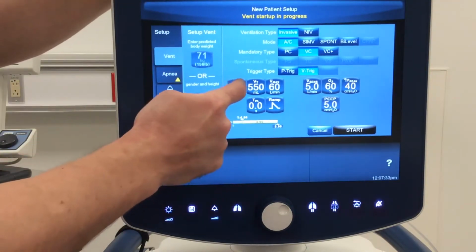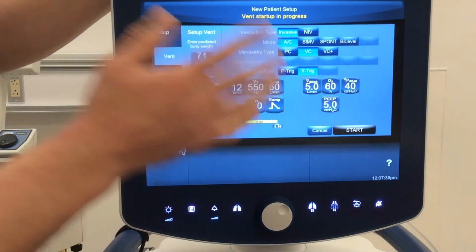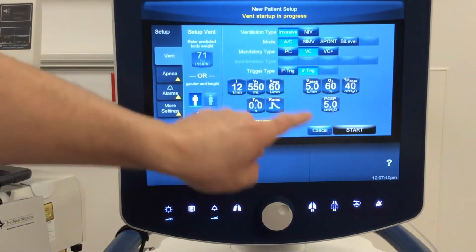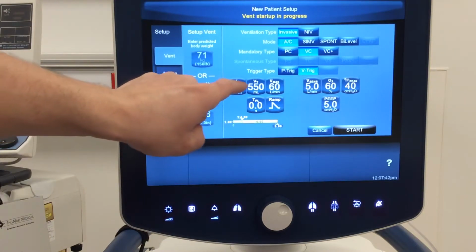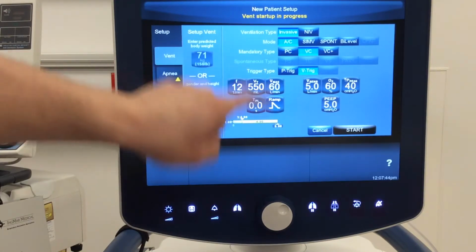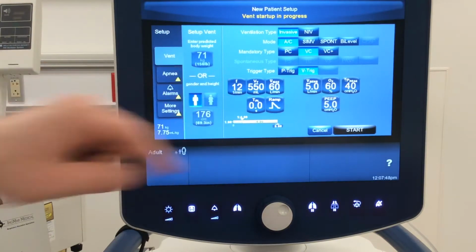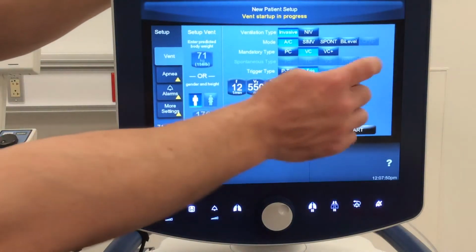Okay, remember, by us setting this respiratory rate, we were setting the longest period of time, in essence, that patient could go without triggering a breath. Every time they trigger, it resets that timer. So they may never get a time triggered breath. It could be all patient triggered if they're breathing faster than what that set cycle time is, or that set rate. Let's talk about one last thing here.